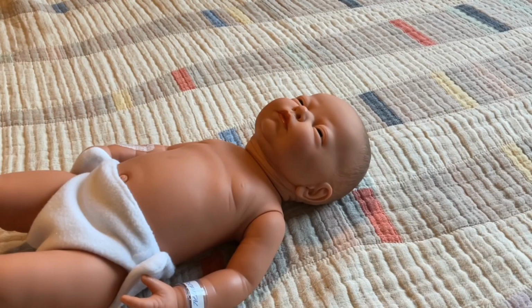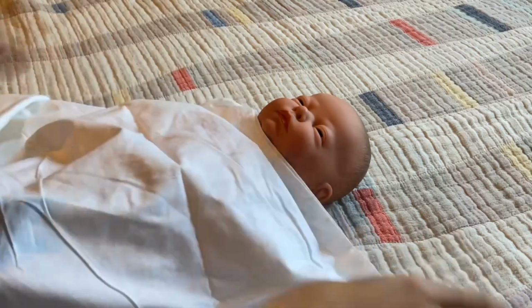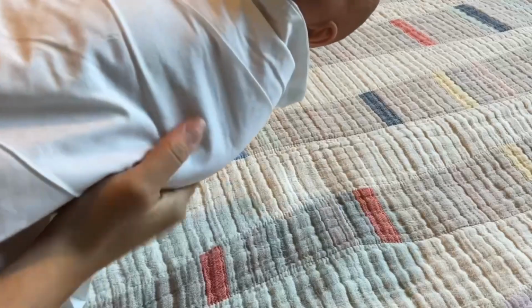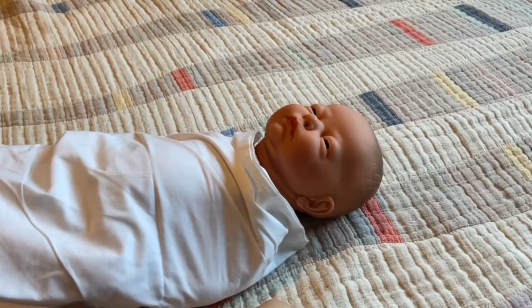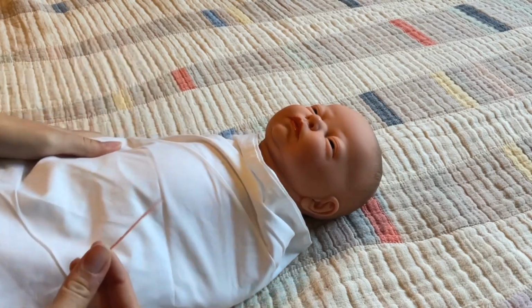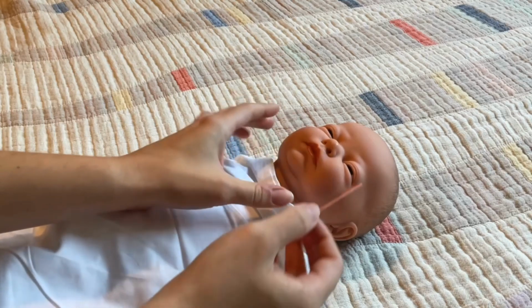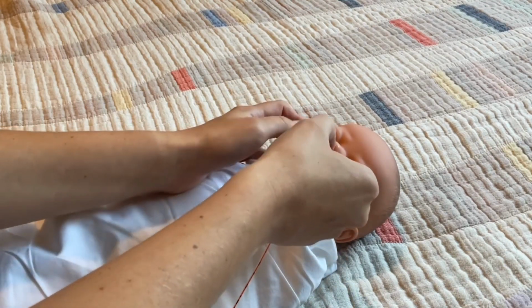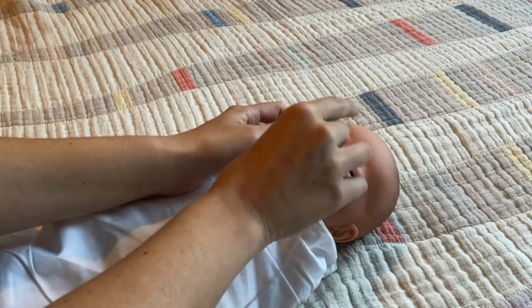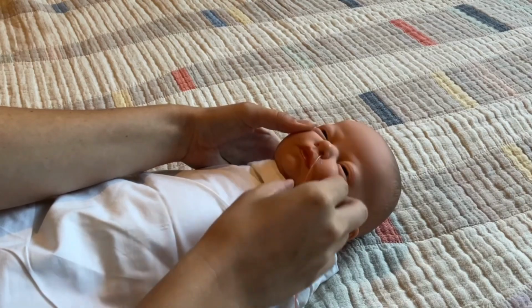Now, to keep from baby pulling out the tube while you're inserting, you can wrap the baby up in a blanket. That way their arms are contained and they can't pull. Look and see which nostril you want to use. We're going to use this one. And slowly start inserting the NG tube into the baby's nostril. You can pull the baby's head chin to chest and keep inserting.